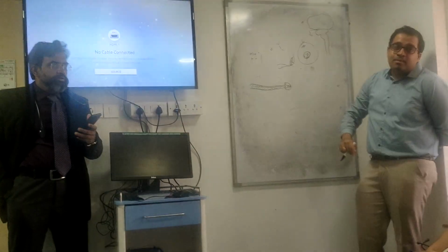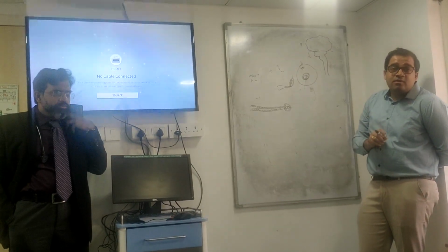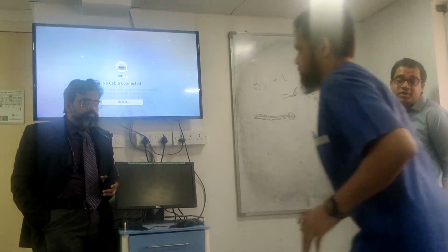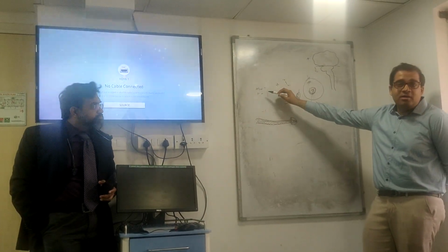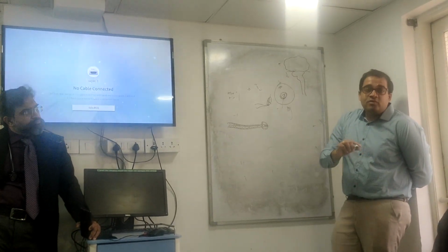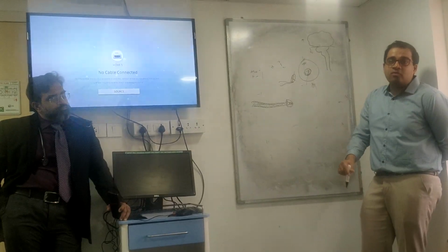How long is it kept in the lab? Last thing. More than 5 days it's kept, 5 to 10 days. Myco F Lytic is kept for 3 to 4 weeks for delayed growth of organisms like fungi and mycobacteria. If a patient has received antibiotics outside, despite the 5th day growth being negative, you ask for the culture to be kept for extended incubation, which is what I do in the lab.